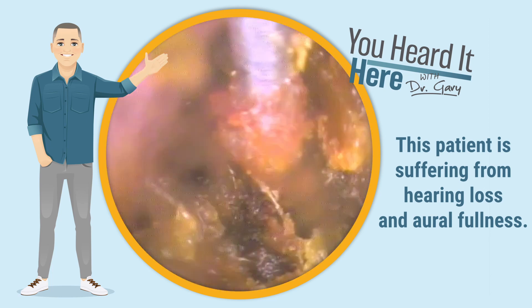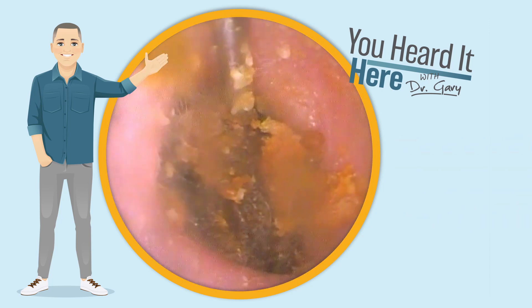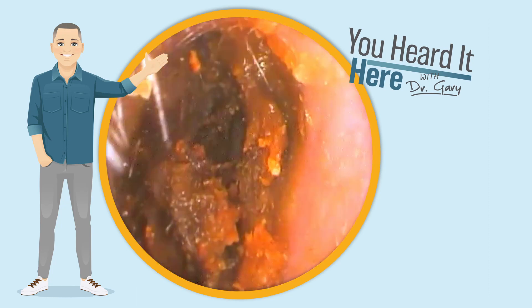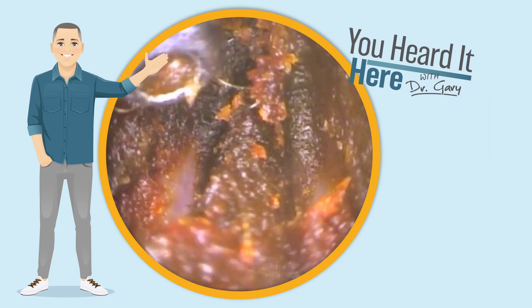Earwax comes in all different sorts of shapes, sizes, colors, and textures, as you've seen on this channel. Remember, our goal is to educate and entertain. This earwax removal stuff is really here for your entertainment. Hopefully you learn a little bit as you hear me talk about different facts associated with the ears.